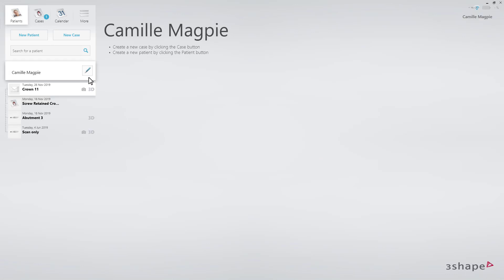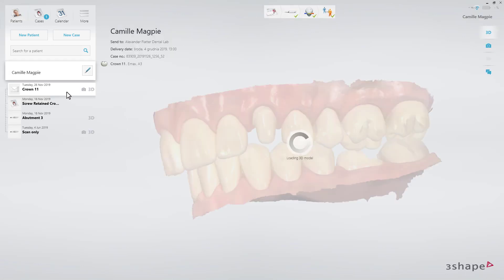Start with a case that has already been sent to a lab. Firstly, right-click on the order and select Copy.